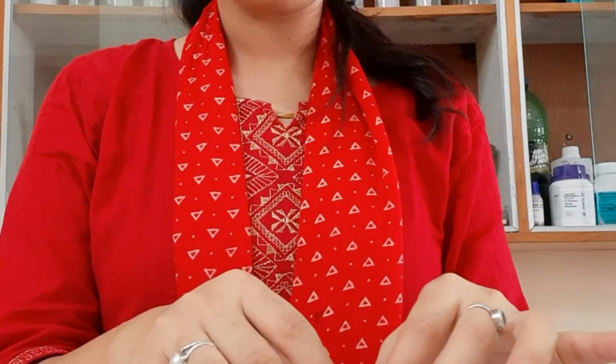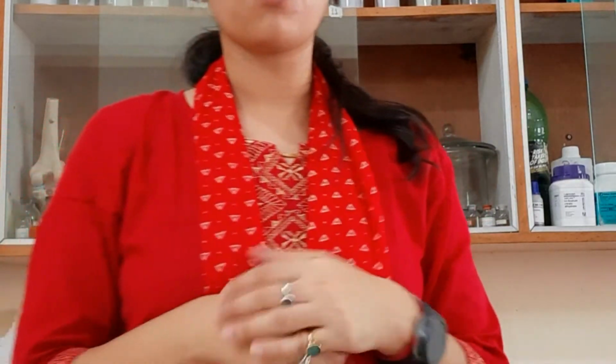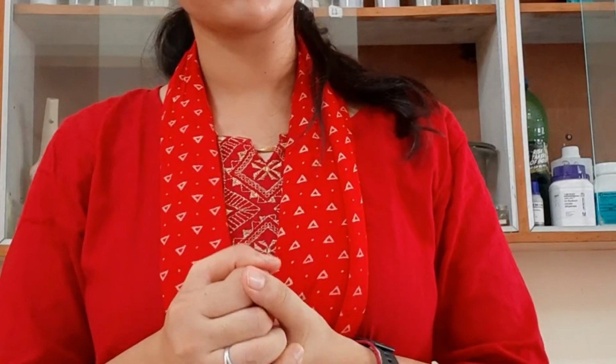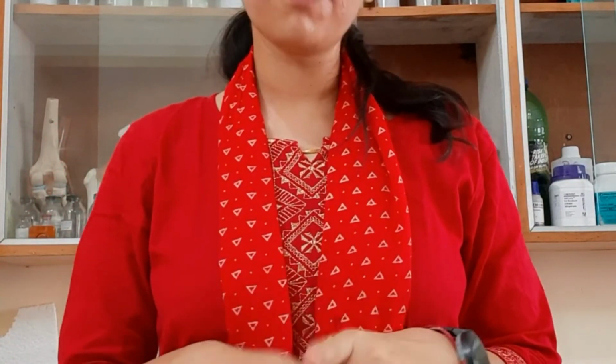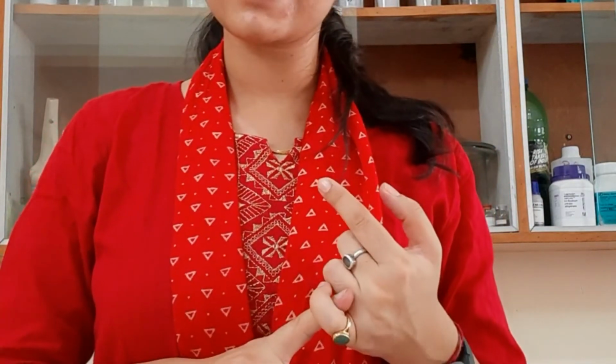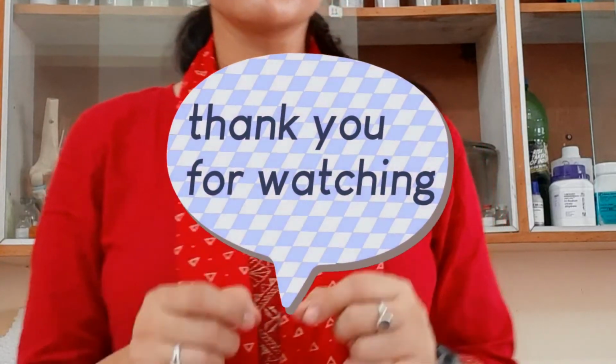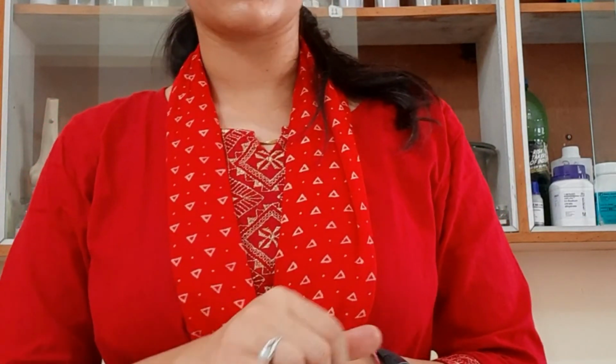So if I ask you how you can confirm the presence or absence of glucose in the urine, we have two tests to perform. We can confirm it through Benedict's test as well as through the Fehling's test. So this was our aim, to test the presence of glucose in the urine.